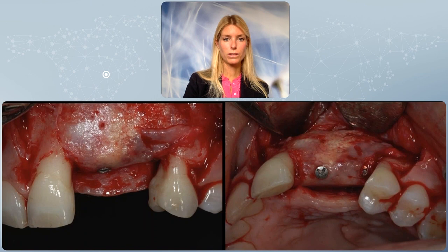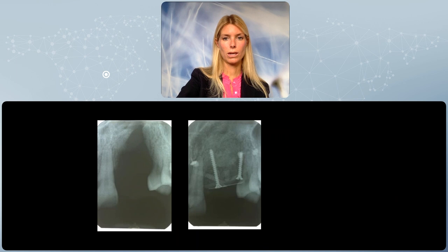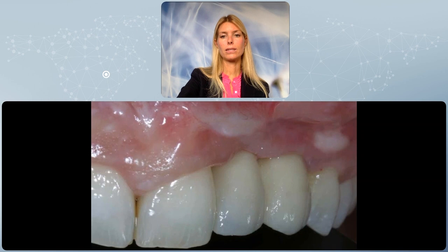The regeneration, which occurred 9 months after, was quite significant, with the complete resolution of the defect. You can see the two heads of the tenting screws and the positioning of the implant. Radiographically, you see the defect, and the post-regeneration radiograph with the tenting screws in place, and the implants positioned in purely regenerated bone. And this is the final prosthetic result, which you may argue is not ideal from a soft tissue point of view in terms of papillary reconstruction, but when you have a 2 centimeter complete defect, this is certainly a spectacular result, with the patient being functional and very happy to be able to carry on.